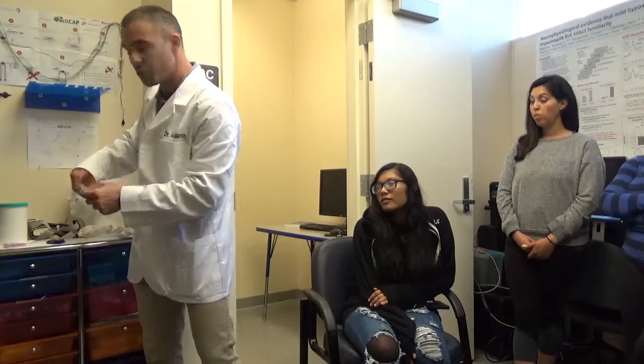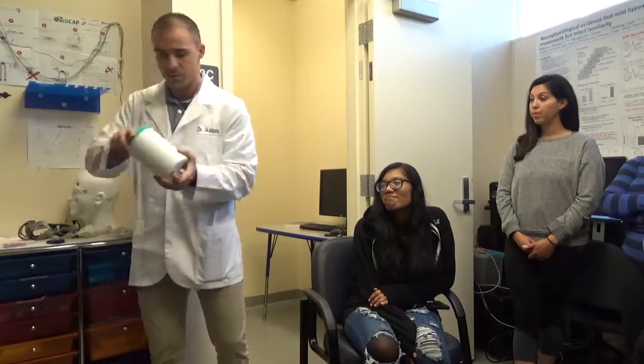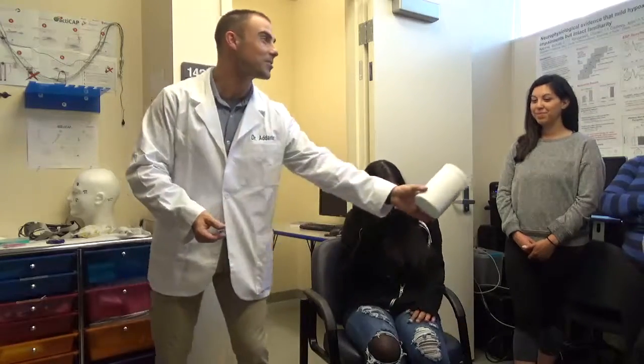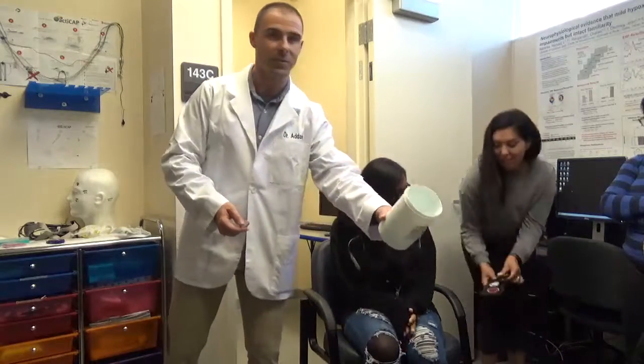Remember I said you would have your equipment prepared already? So you come down earlier, you set yourself up for success. You take your little syringes, and this is our gel. You open this up. All right, that's our gel. Oop, sorry, I was trying to show you guys. How'd that fall off? Okay, so you guys see our gel?